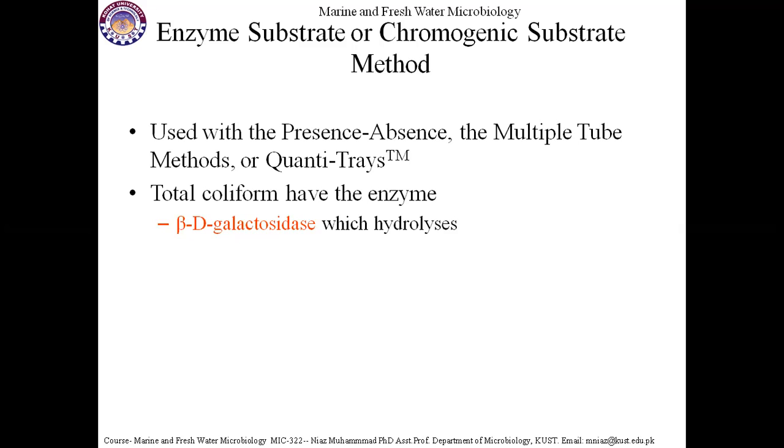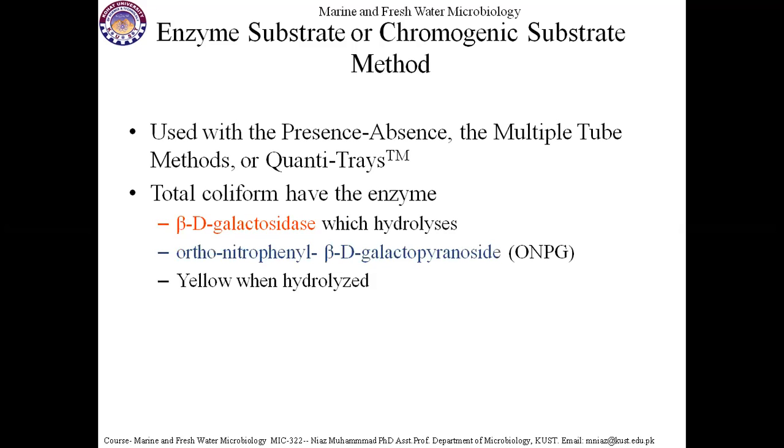This enzyme hydrolyzes orthonitrophenyl beta-D-galactopyranoside, ONPG. So this enzyme, beta-galactosidase, has the ability to hydrolyze ONPG.